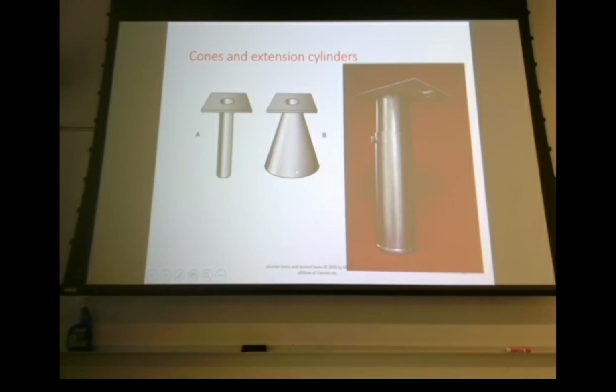Unfortunately, sometimes what we have with these type of collimators is a loss of sharpness of recorded detail, but it's very minor. And it's what you may see referred to as cone cutting.